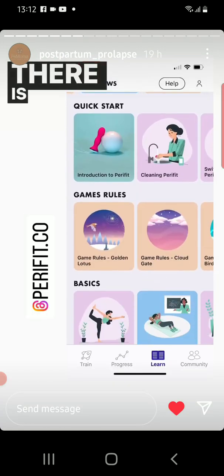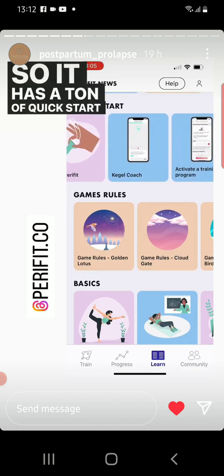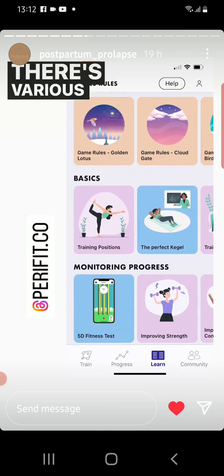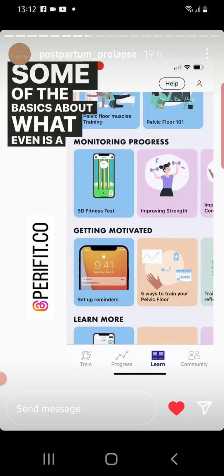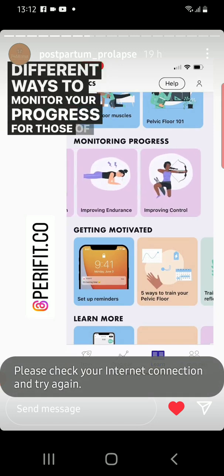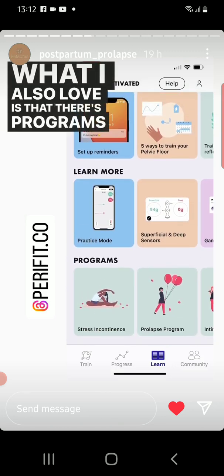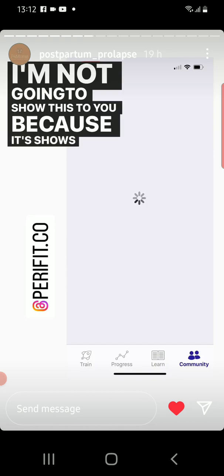There is a lot more in this app than just what I've shown you. It has a ton of quick start information if you're new and not sure how to use it, various games and how to play them, some of the basics about what even is a Kegel, Pelvic Floor 101, different ways to monitor your progress for those of you who have different goals. What I also love is that there are programs, and there's also a community — I'm not going to show this to you because it shows people's names.